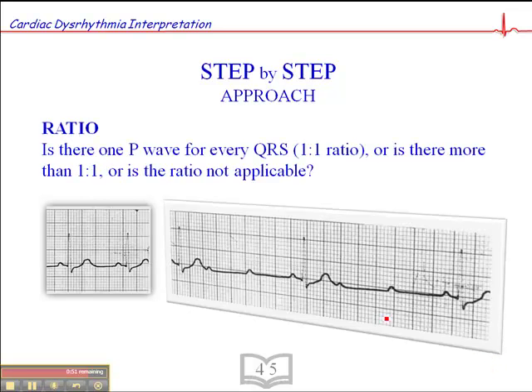Then we look at the ratio of P-waves to QRS complexes. Normally the ratio is 1 to 1 — one P-wave per QRS. In the example shown, there are 3 P-waves per QRS, which is a 3-to-1 ratio. We see that in heart blocks.